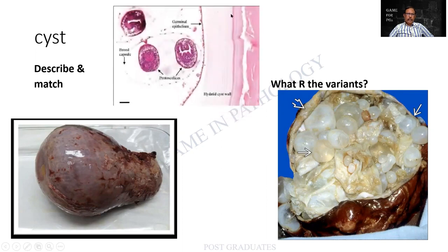And this is what you people see. This is a pericyst that is there, and then there is the inner wall which has got a laminated appearance. Then there is a germinal epithelium from which there can be the brood capsules. Sometimes grossly it is felt as a hydatid sand. The scolices will be refractile, and we will be able to see them in our histology slides if we are lucky.